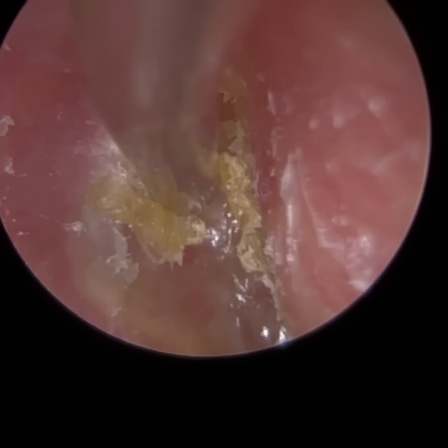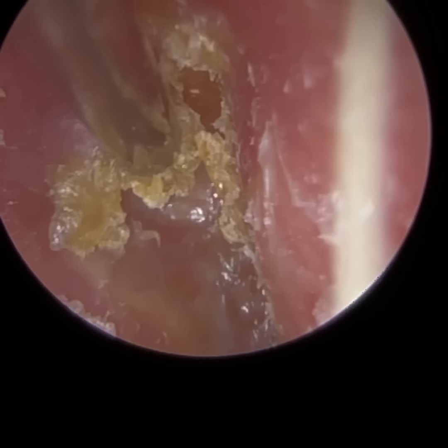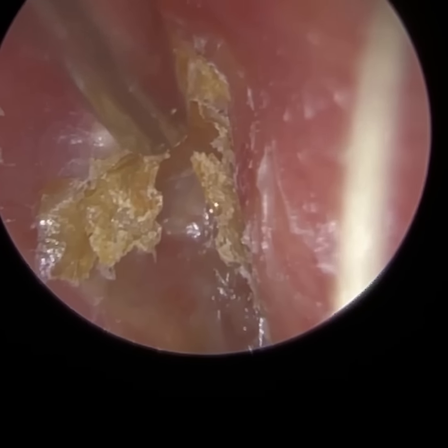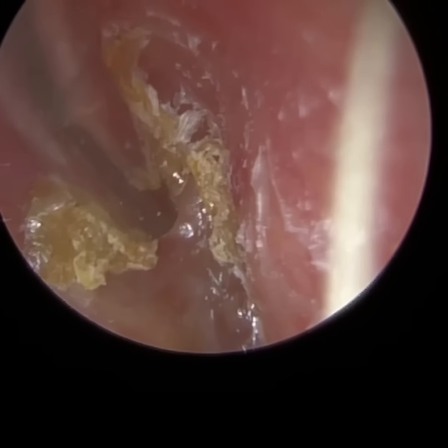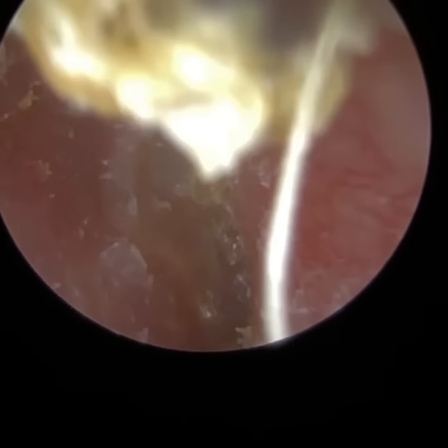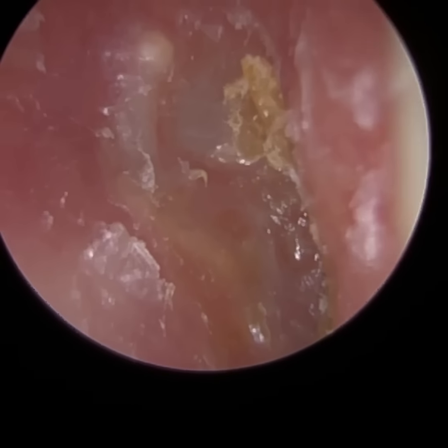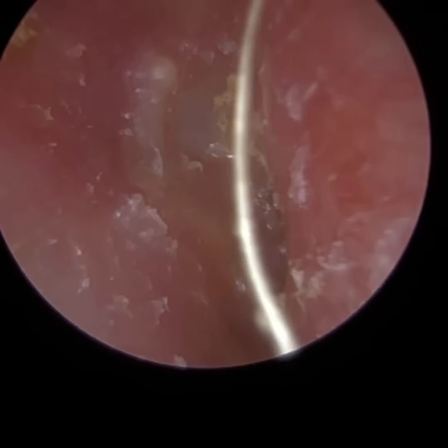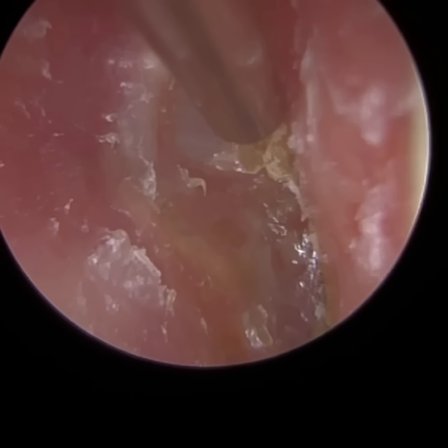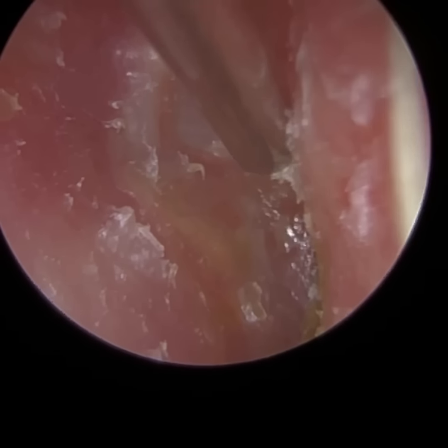Sometimes people can have stenosis, a narrowing of the ear canal due to chronic outer ear infections, or surfer's ear, so exostosis. That's when the bone deeper in the ear, in response to cold wind or air, the blood vessels dilate, and that helps to stimulate bony growth, so you get bony spurs, and that can also cause the narrowing of the ear canal. In addition, the patient's got quite a prominent, on the opposite side, on the anterior canal wall, the front part, there's a bit of a recess, and that's where I am now.